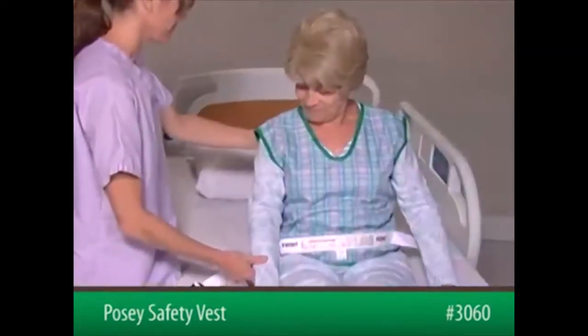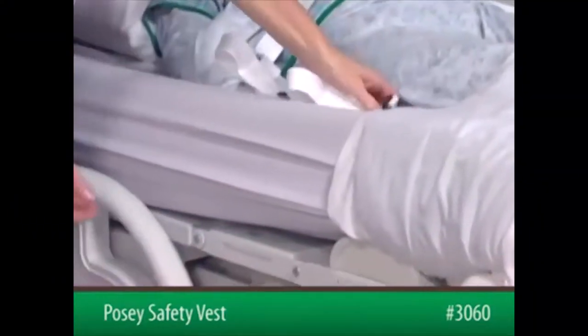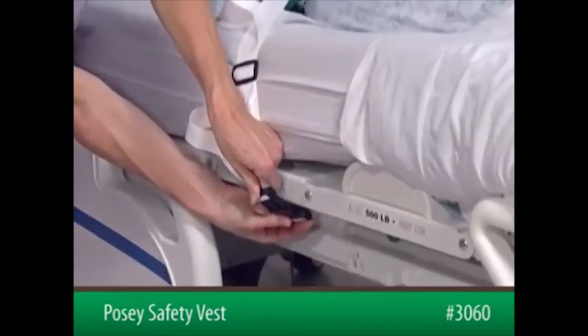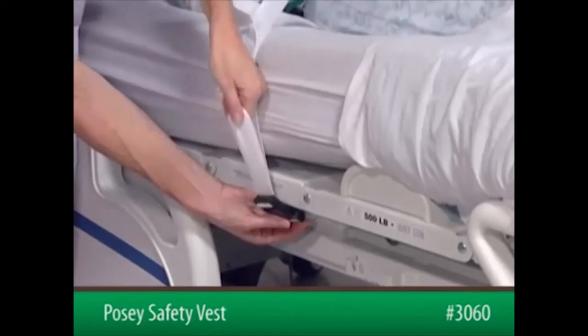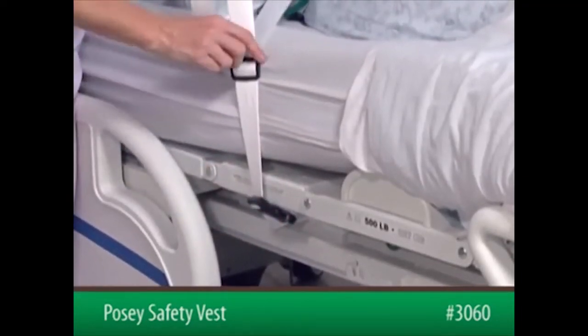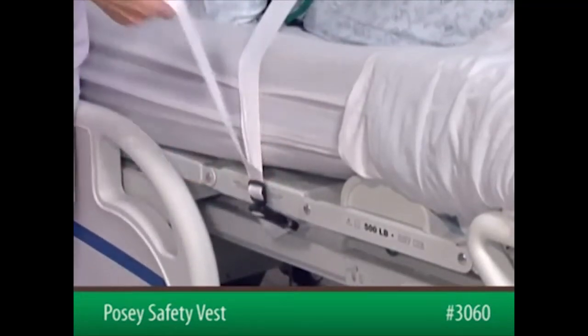Now, position the patient in the bed. Insert the male end of the connecting strap into the female end of the short strap — listen for a snapping sound. Pull on the top strap to adjust the slack. Move the slide buckle down to the quick-release buckle. Tuck any excess strap out of the patient's reach.